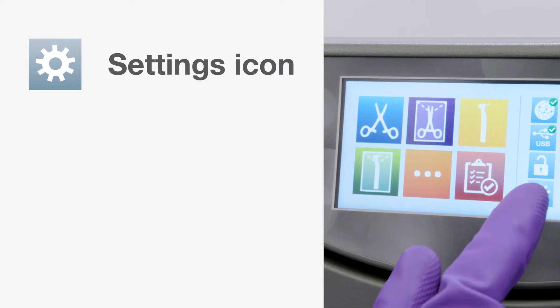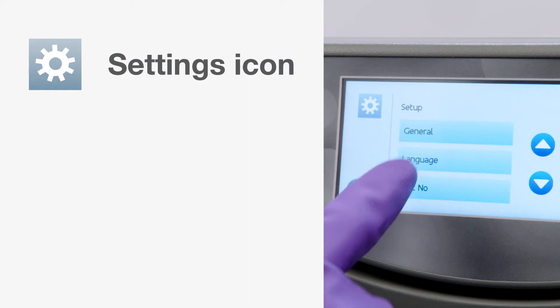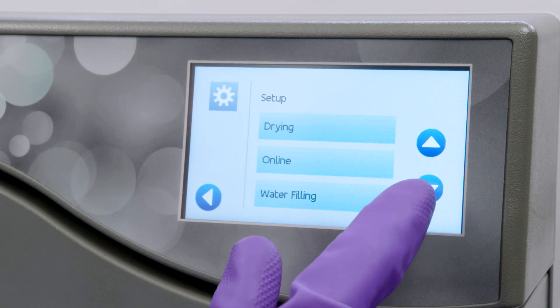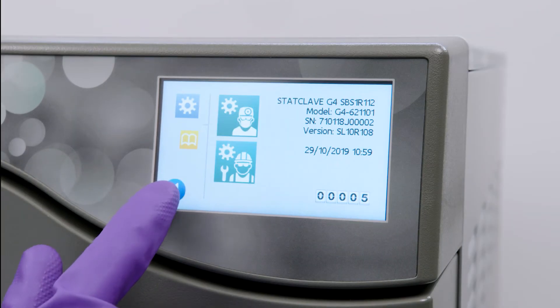The final icon is the settings icon, which allows you to adjust the user settings menu. Features such as setting up load traceability, user IDs and pins, setting drying times and standby mode are helpful features explained in detail in your operator's manual.